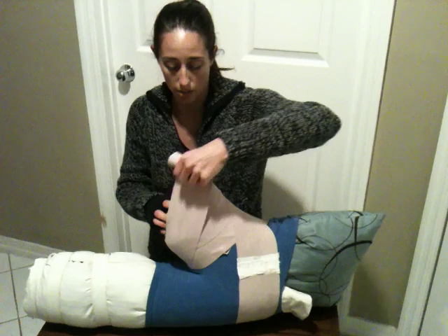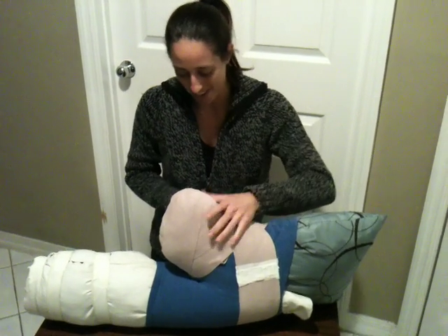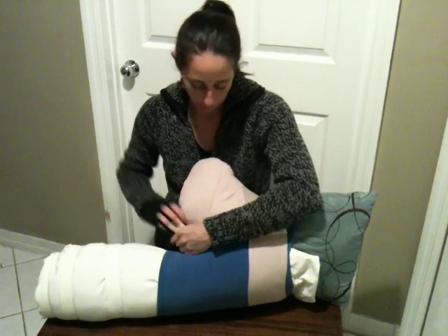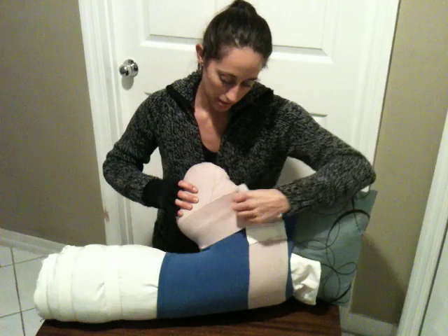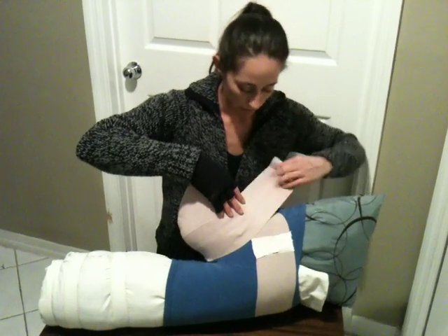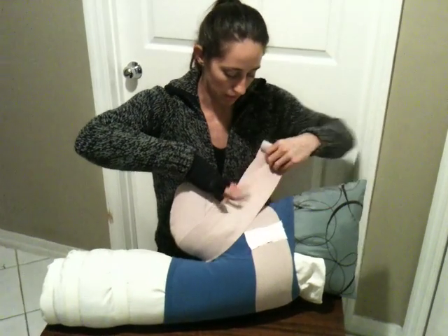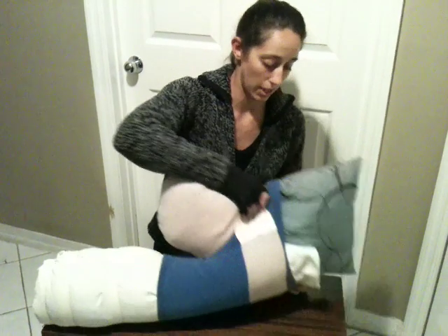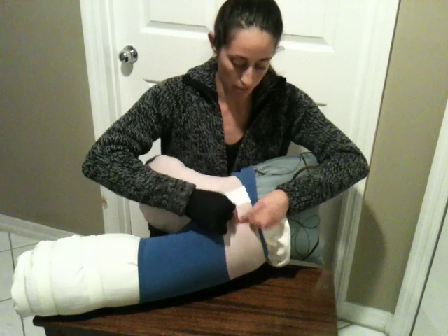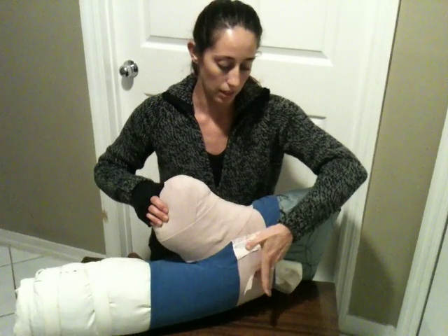I chose a four-inch ace wrap for this mainly because that's what I had and could find. In the video it looked like she had a six-inch ace wrap, but for the size of my pillow person here this seems fairly accurate. She anchored her wrap on the front of the hip. Because mine is longer I'm going to keep going, but I assume you're supposed to anchor anteriorly. I don't know if it matters if you anchor on the hip anteriorly or on the leg anteriorly, but that's where we'd end and I would tape it there.